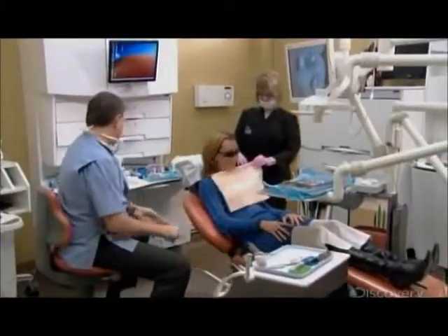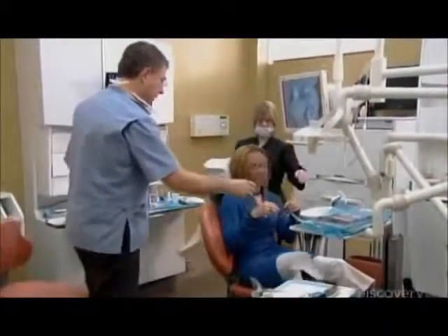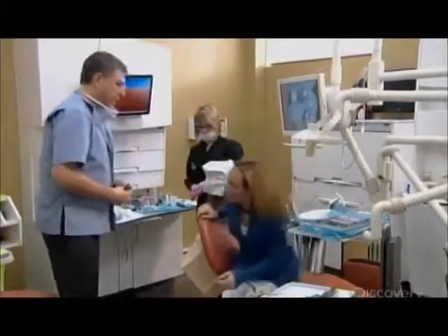It's taken just an hour and a quarter for her custom restoration to be designed, milled and installed, all thanks to digital dentistry.